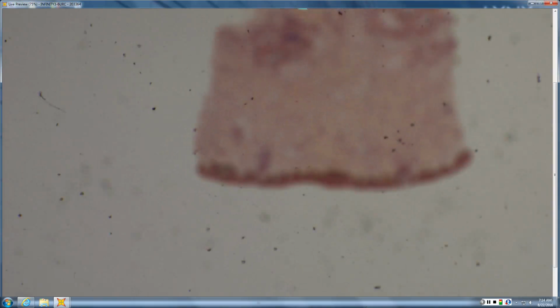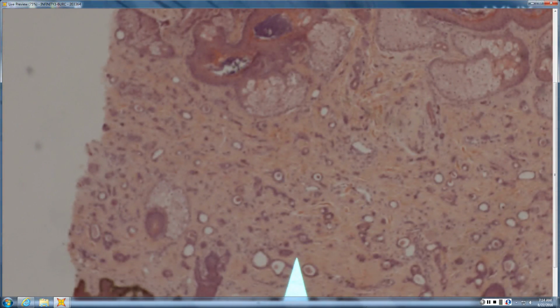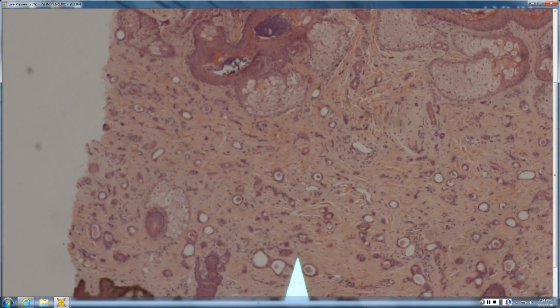Okay, so this is the one that I told you the answer is paisley tie differential, and that's because it is not necessarily as clear cut as you would want it to be. So certainly these are little paisley tie, tadpole-looking cells. It appears that they are true ducts. You don't see the keratinaceous debris or horn cyst. What's inside these little ducts is more the sweat gland type. But it is pretty broad.